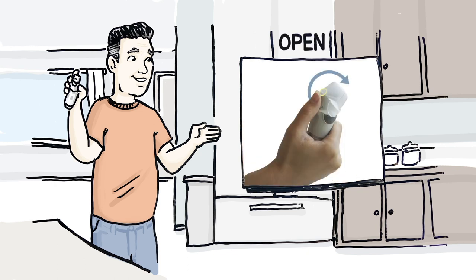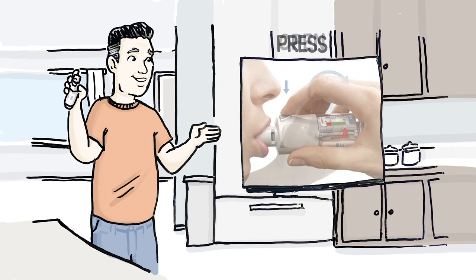For open, he pushes on the small circular tab until the cap snaps fully open. Press is how he takes the medication. He starts by breathing in and then out slowly and fully to empty his lungs.